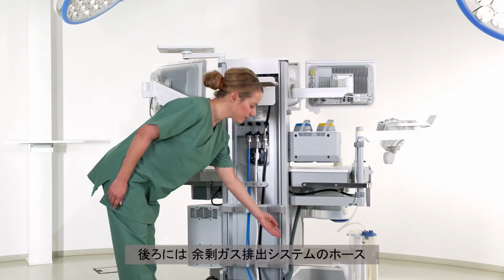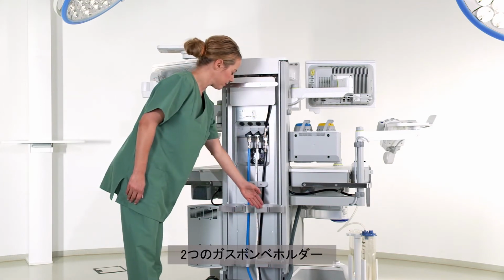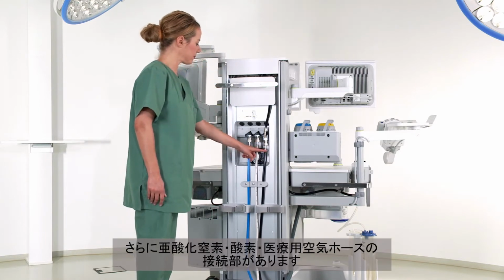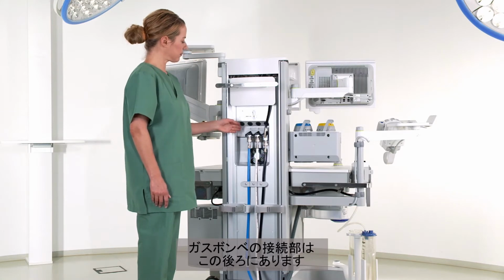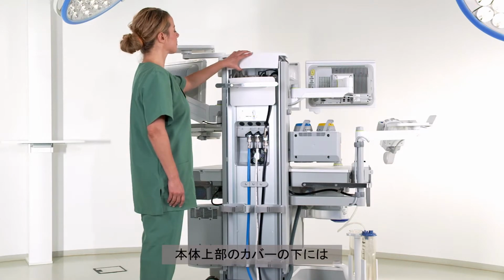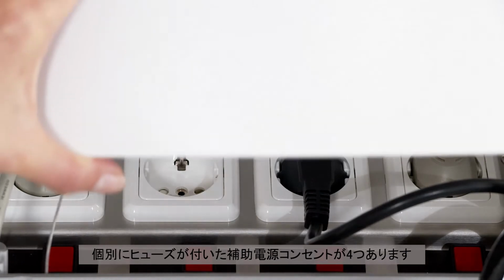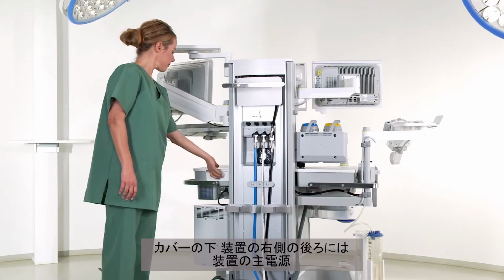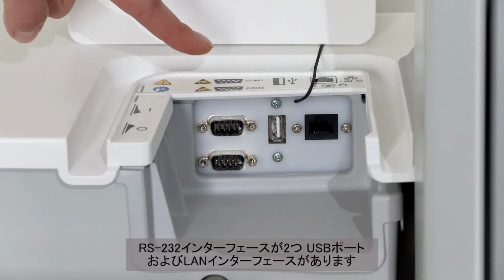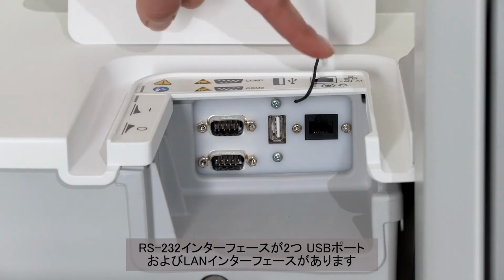On the back you can see the anaesthetic gas scavenging hose, the receptacle for 2 gas cylinders, as well as connections for nitrous oxide, oxygen and medical air. Connections for additional gas cylinders are located behind this. Under the cover at the top of the column, you will find 4 individually fused power sockets. Under the cover at the back right-hand side of the machine is the device's main switch, 2 RS-232 interfaces, a USB port and a LAN interface.